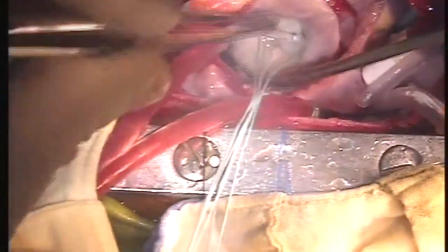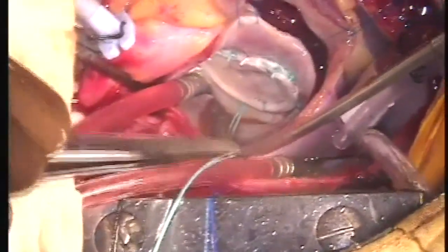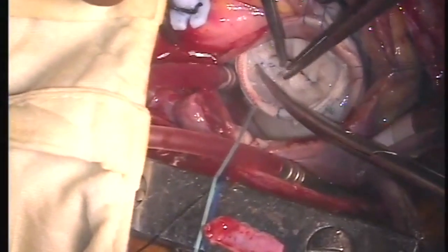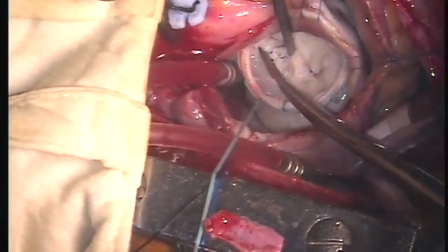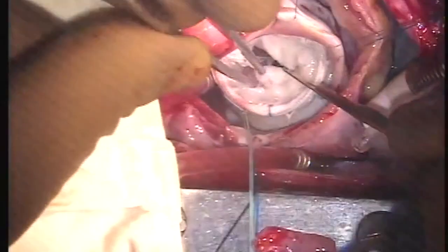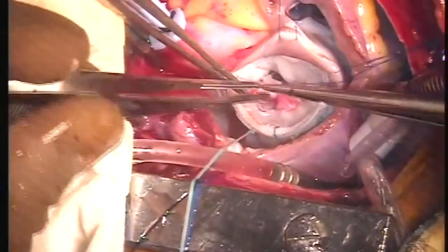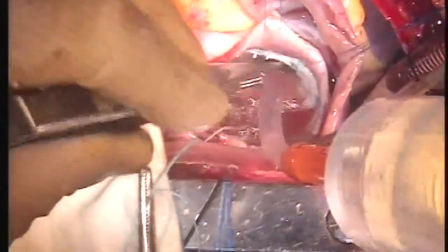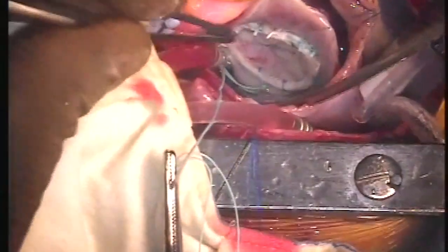The saline testing is performed which shows a competent valve. The annuloplasty is done with a 28 size CG Future ring, but we can see a small gap with residual MR at the P1 P2 segment. So this segment is now augmented with autologous glutaraldehyde fixed pericardium. Now saline testing performed, I see a competent mitral valve without any mitral regurgitation.